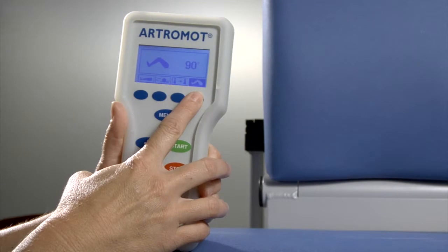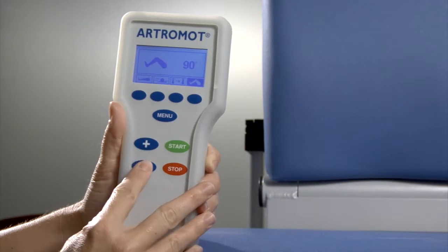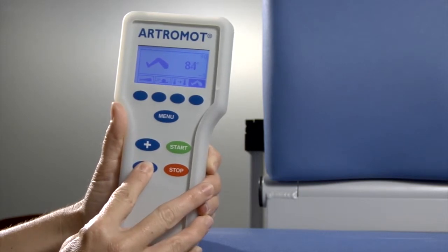On the right side of the display, you will see a picture of a bent leg. This is the symbol for the flexion setting. To adjust the flexion limit to your prescribed or desired limit, press the blue button below the flexion setting and change using the appropriate arrow.